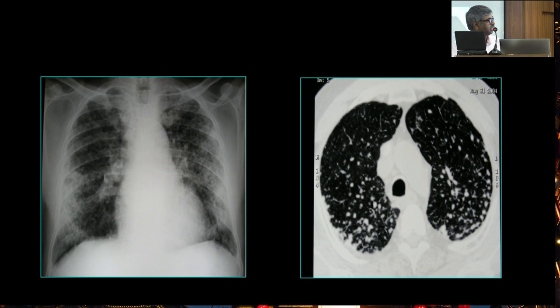And this X-ray is again a very interesting X-ray. Our own patient, he is actually a person who is working in rock shelling and that sort of work. And he has multiple calcified nodules in the lung. And this is the interesting finding. Unfortunately, the pointer is not working properly. Okay. So if you look carefully into the hilum.